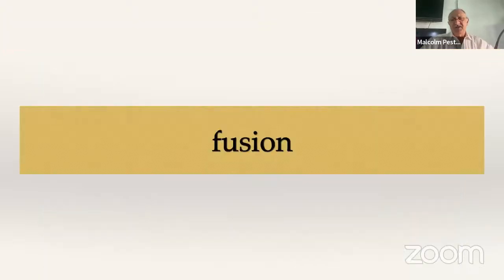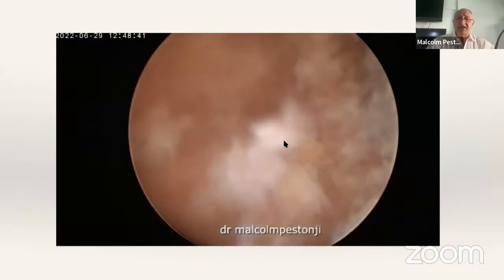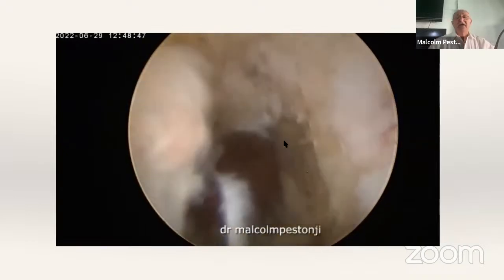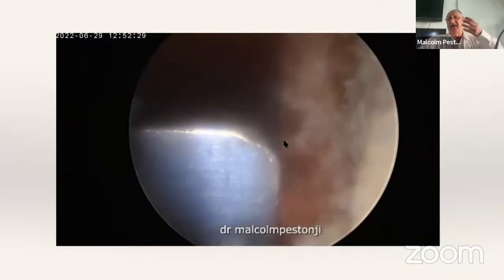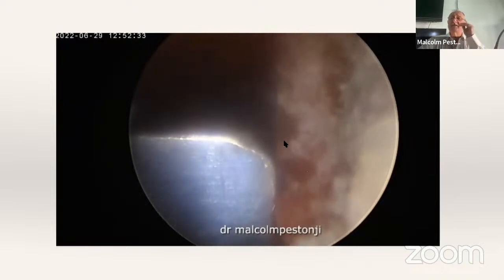Fusion has been one of the bugbears of our times, but I feel that fusion now is very easy, very safe. I have developed a special technique, which I call an extra-foraminal fusion. Here you see the end plates prepared, the graft is inside, dura is not exposed, it's an XLIF and an XTLIF. So I'm coming right out in the foramen, secure the exiting nerve root, put in the cage.